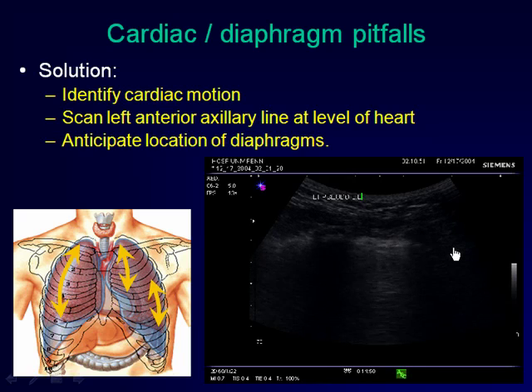That's normal, and certainly is a little bit easier to figure out when one's actually got one's hand on the probe in the appropriate location on the patient's body, compared to a clip like this where the viewer is not certain exactly where the examiner has their probe positioned on the body.